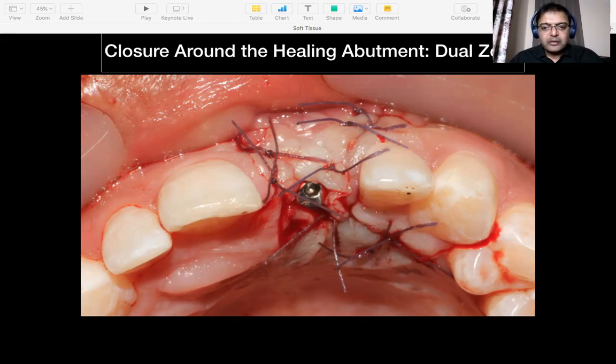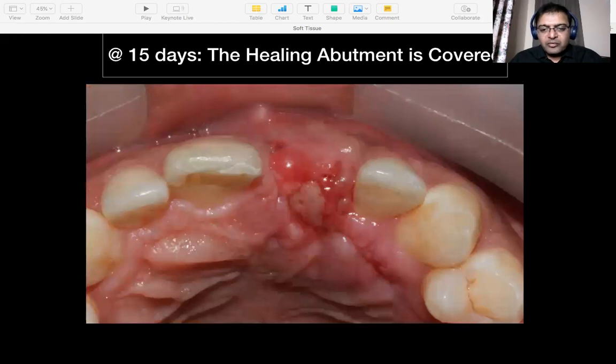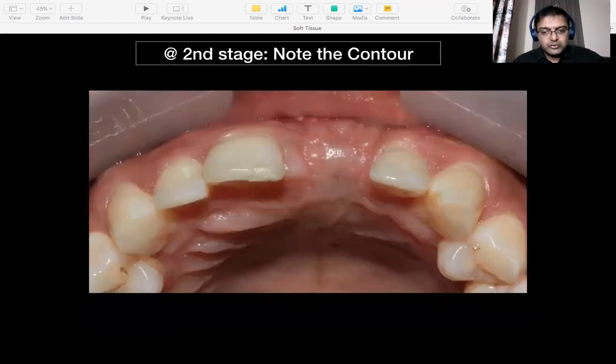blood supply. And you see that though some amount of the healing abutment is exposed, by the time the patient came back for suture removal 15 days down the line, the tissue has covered up. Why? Because the connective tissue is alive, it was carrying its own blood supply, so there's no deficiency of nutrition, and the epithelium then grew over this connective tissue, and that's why you see a primary closure at the end of 15 days, though you didn't have it on the day you actually sutured it.